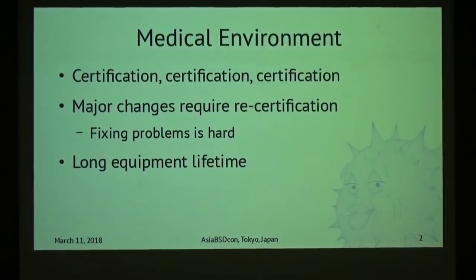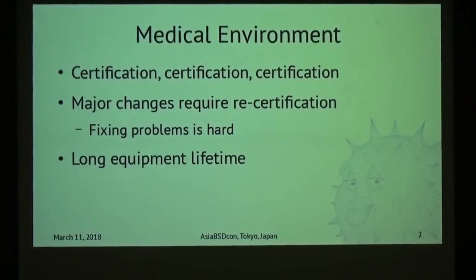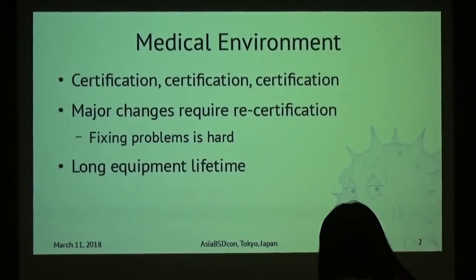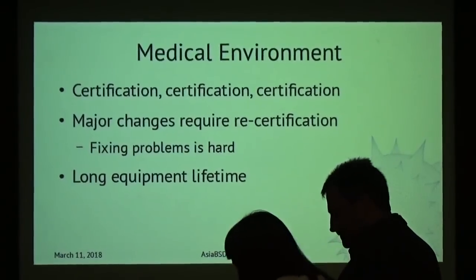Medical environment means certification, certification, certification, and if you're done with that, even more certification. That also means major changes are hard to do because they require recertification and then another certification, which in turn means fixing problems there is really hard, and you've got to get your stuff right on the first shot pretty much. At the same time, the equipment there has very, very long lifetime. It's not the usual lifetime we're used to in the IT industry.